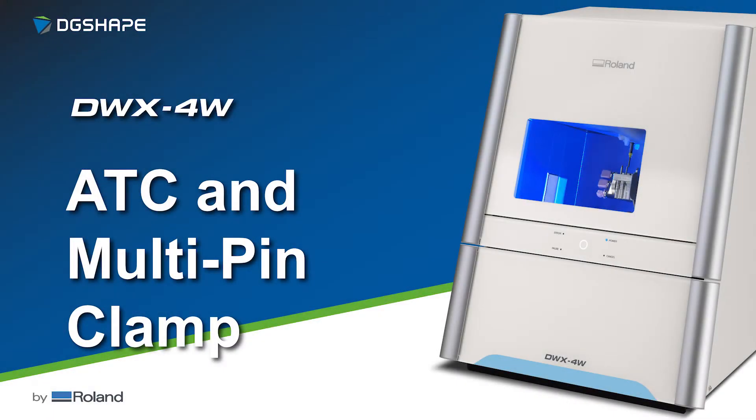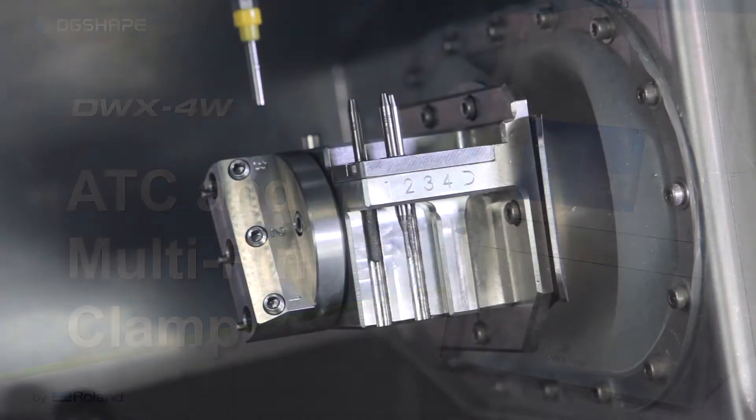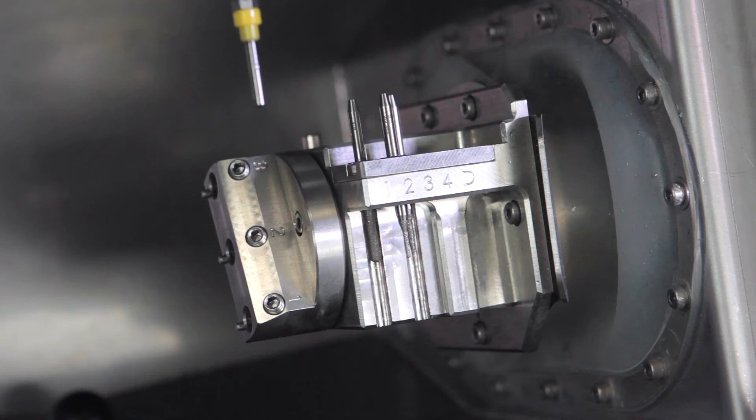The DWX-4W Dental Mill is equipped with a 4-slot automatic tool changer and a multi-pin clamp that allows up to 3-pin type materials to be loaded.